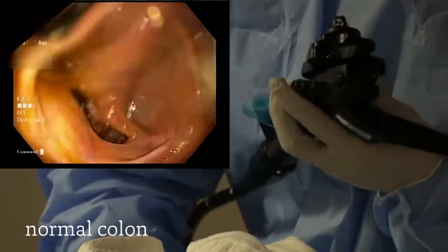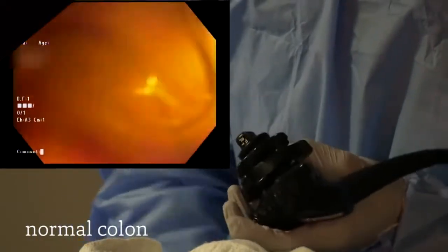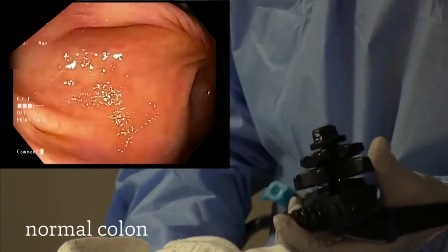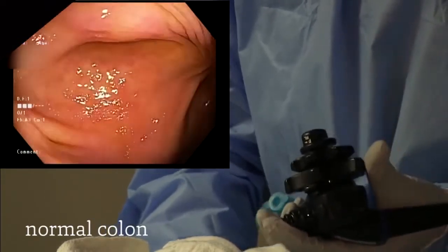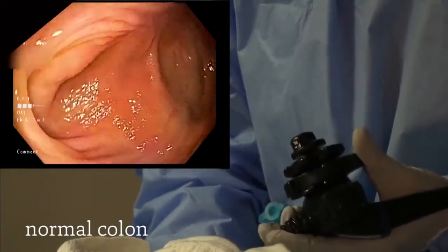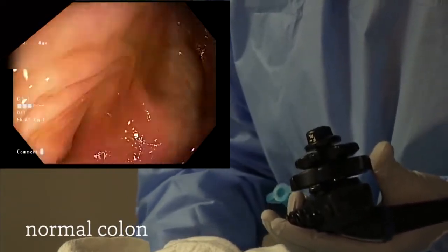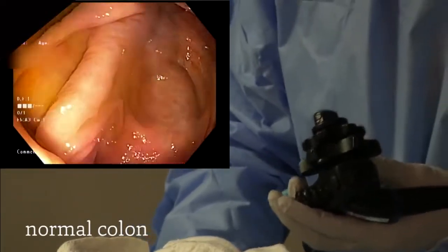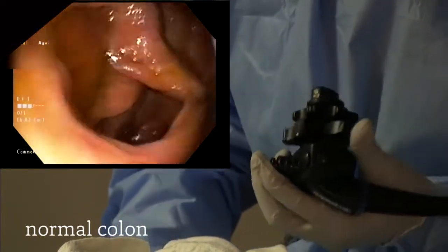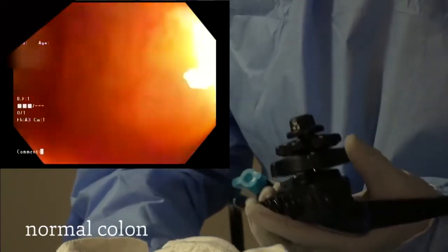We are currently in the ascending colon and about to enter the cecum. You'll notice you've reached the cecum by looking at the landmarks. What we're looking at there is called the appendiceal orifice — on the other side of this orifice is your appendix. To the left, you will notice the ileocecal valve. This is a valve that can be traversed to reach the small intestine called the terminal ileum, which we are currently entering now.